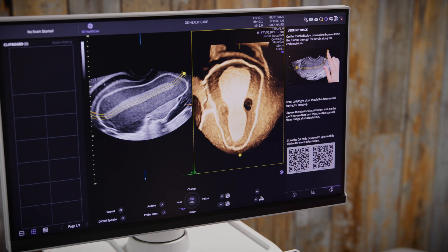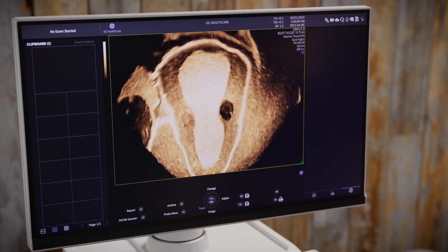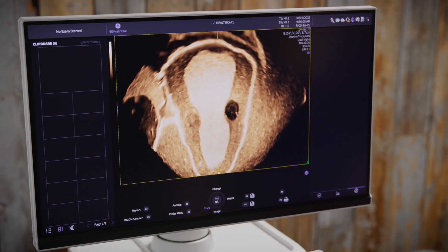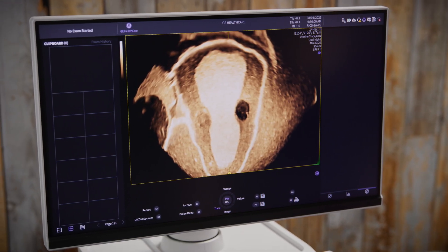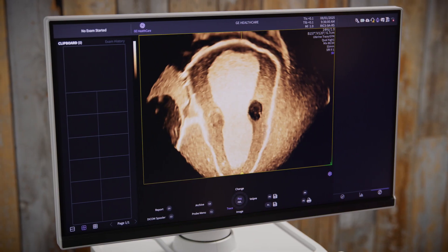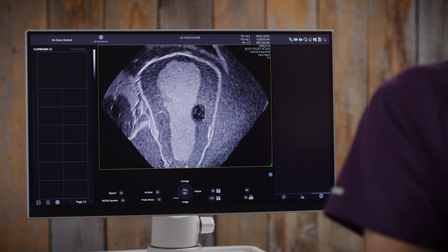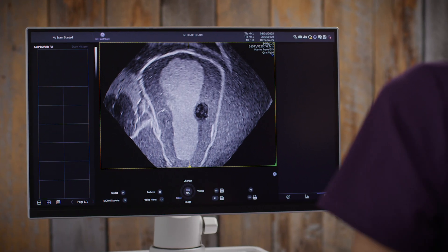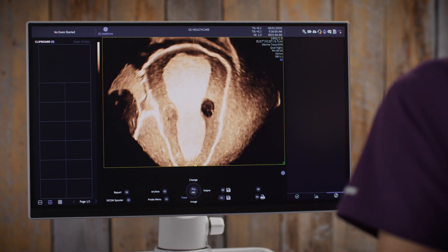Volume contrast imaging, or VCI, is applied to the coronal view of the uterus by default. VCI provides better visualization of anatomical structures, reducing background noise and improving image clarity. Notice the increased detail and clarity in the image when VCI is applied.